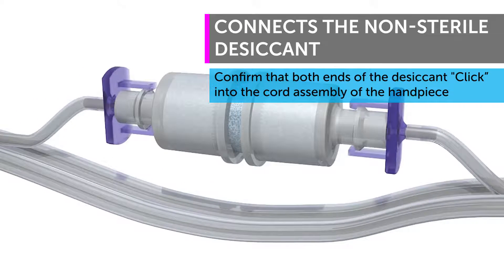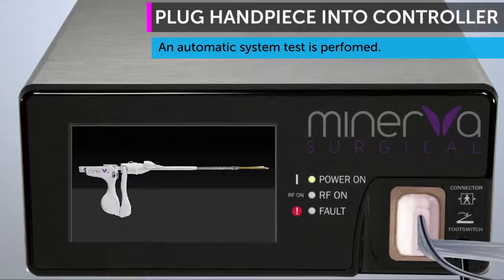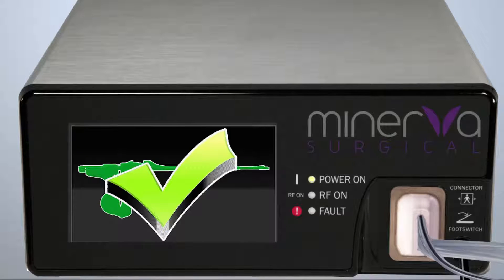The assistant connects the desiccant and plugs the handpiece into the controller. An automatic system test begins, which takes approximately 7 seconds and must be performed with the Minerva handpiece external to the patient.